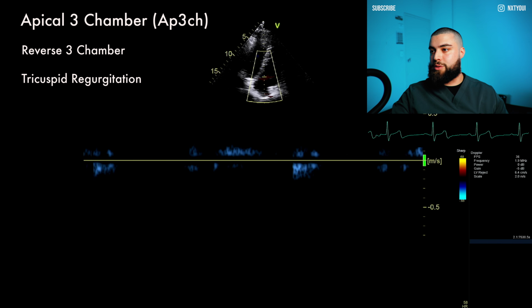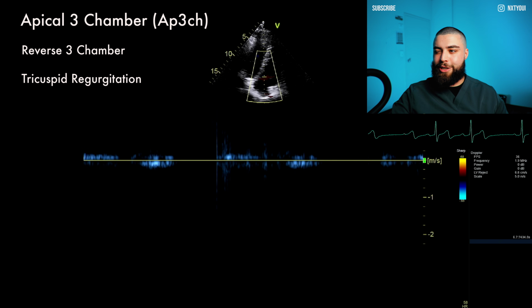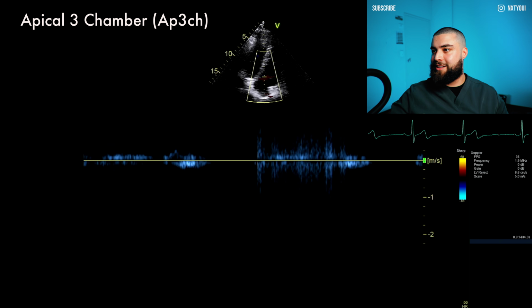We're not going to see anything because it was trivial. Sometimes this works, sometimes it doesn't. But when it does, you're going to feel very rewarded that you found the highest signal for that TR.